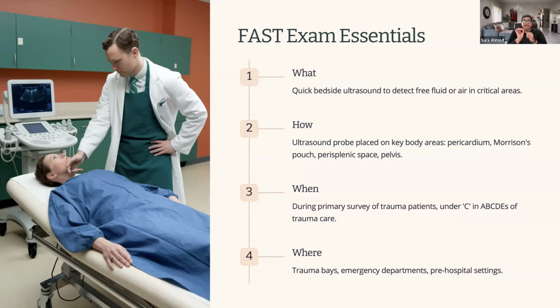Globally, the exam is especially valuable in resource-limited settings where access to advanced imaging like CT scans may be delayed or unavailable. This makes it a universal tool for care.